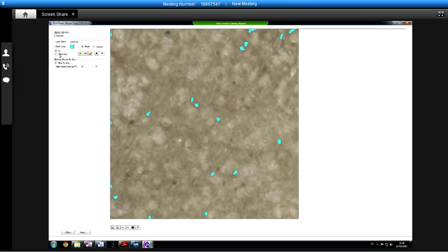What I'd say there is if you look at the colour of that one, it's got a dark brown area and a light brown. Maybe we've actually selected a little bit too much light brown. Maybe the correct way to do it is actually to go for the darker brown. Are we missing any? Are we failing to put a marker on any positives still? I don't think we are. And that's because these have become sort of smaller objects, isn't it?